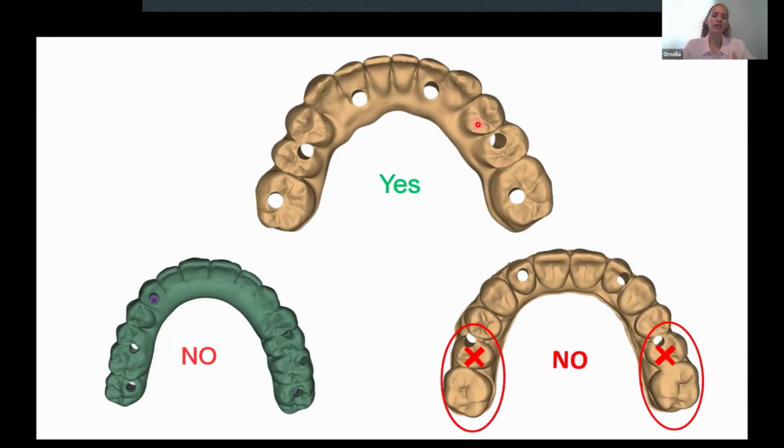If we see the image in the bottom, for example, all-on-4, we have to think that only 4 implants are supporting the forces of 3 elements, okay? So the distribution of forces is not the same if we have 4, 5, 6, or 8 implants, okay?